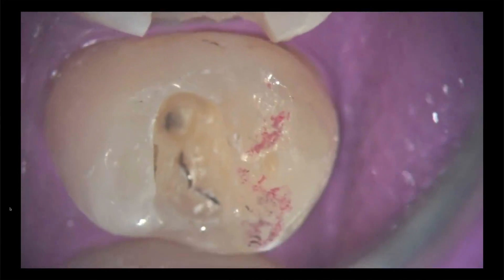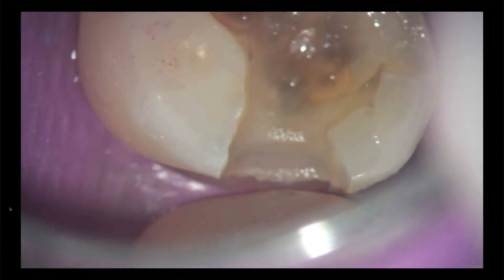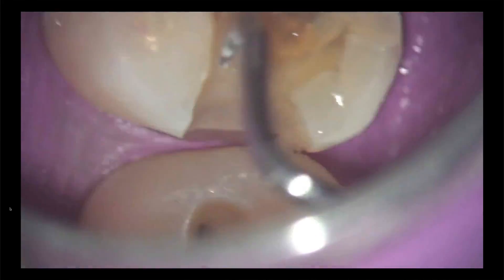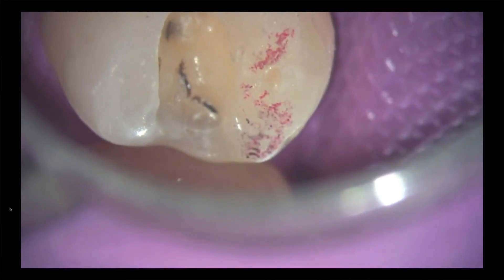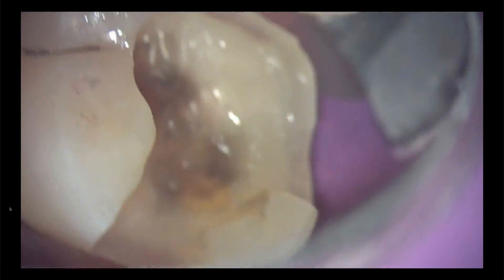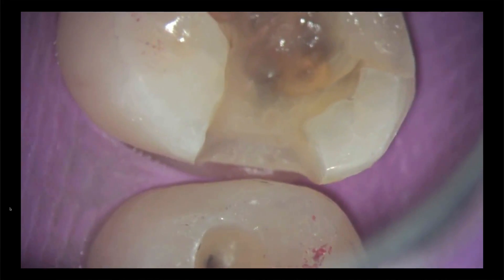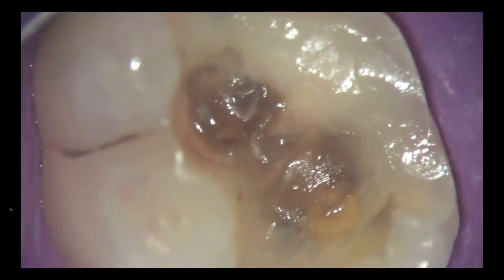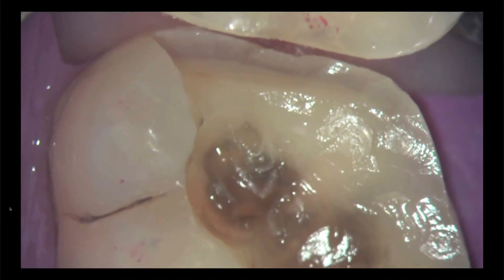Now, if you look, when I focus this there, you can see it's a little bit ragged. So there I'm going in with that scaler and I'm smoothing out the enamel floor surface. And now you can see how smooth that is. Just checking the occlusal amalgam that I removed on the bicuspid as well. And then the distal looks pretty good. So I'm just trying to get it focused a little better. If you've ever used a scope in the posterior, you can see how it's harder to focus the video camera on the scope. So that gives you an idea of all these margins. It's just really precision level of smoothness and dentistry really. That was a good image of it right there.